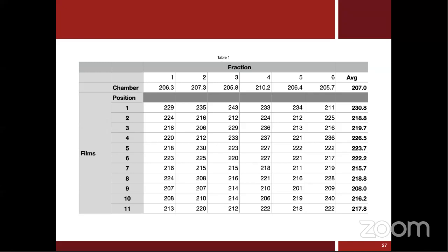Look for a 48-bit scanner, and look for a scanner that can give you 300 dpi. I think most scanners can actually save images with those resolutions. But look for a 48-bit scanner, because with 24-bit scanners, that's already a 5 centigray uncertainty of whatever you're going to measure.